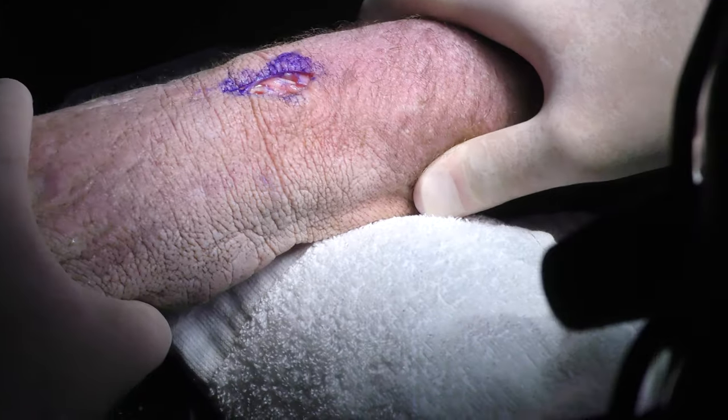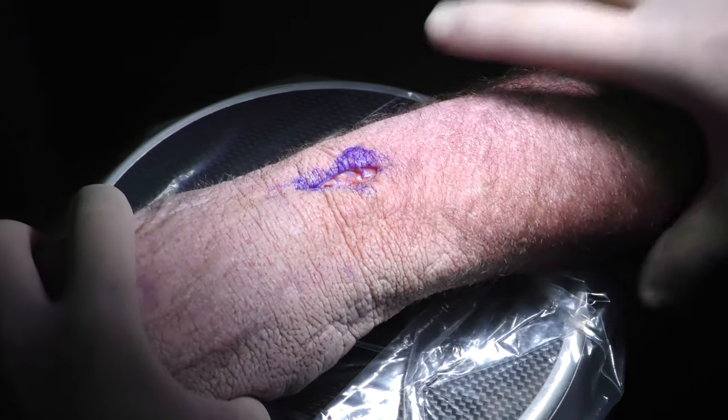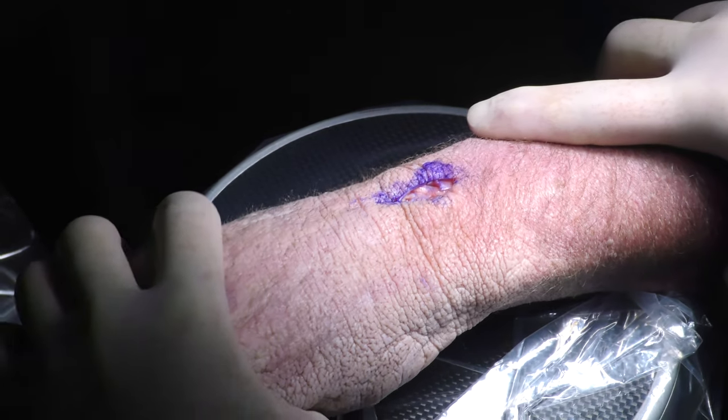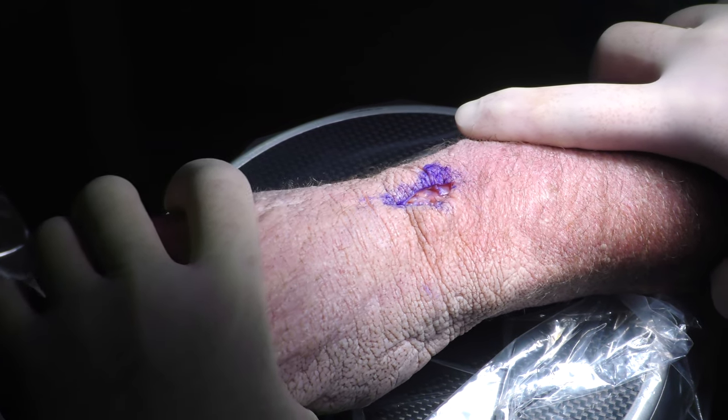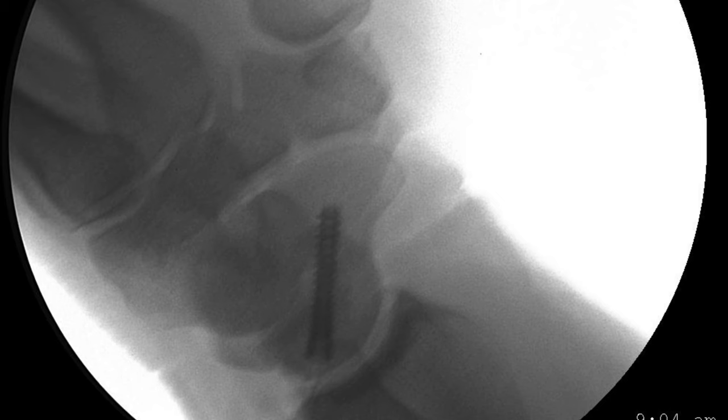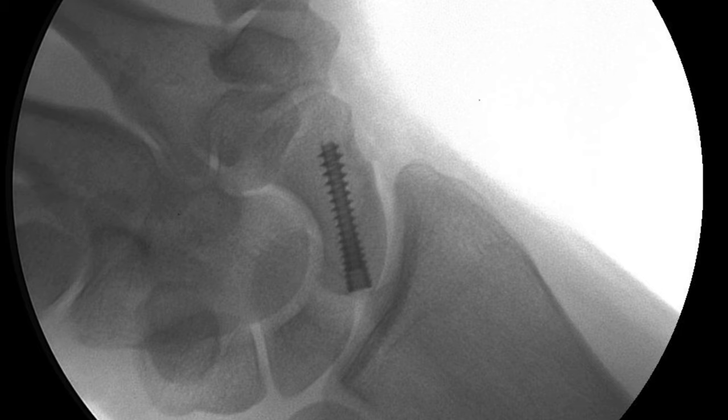So then when you want to see where the screw is in the scaphoid, you're in the central third. If you dorsiflex the wrist and ulnarly deviate the hand a little bit, you'll get a good picture about where it is. That would have been really good for a scaphoid waist fracture. And when you rotate around, you'll see where it is. And then, of course, on your lateral, you can see it down the central part of the scaphoid.